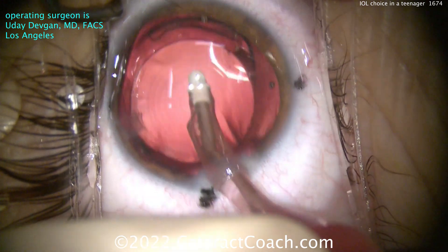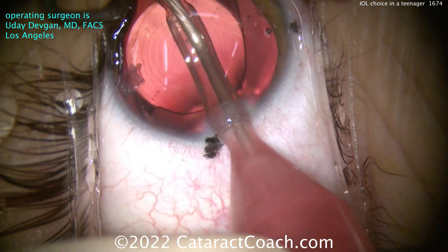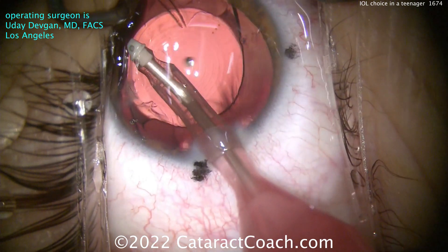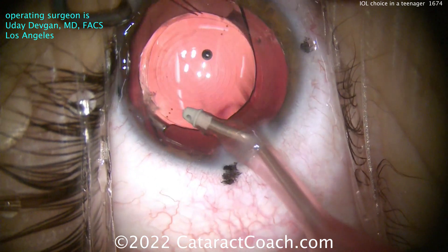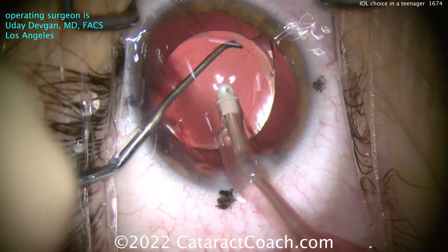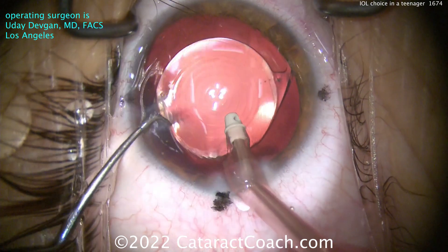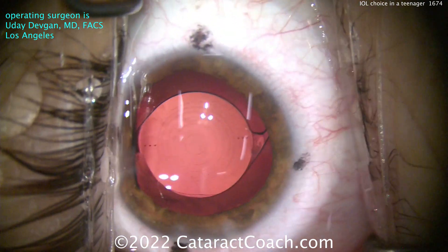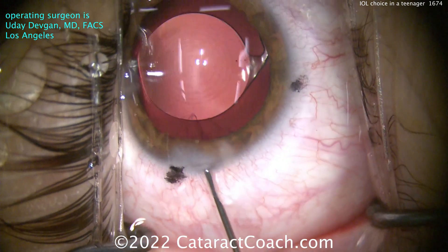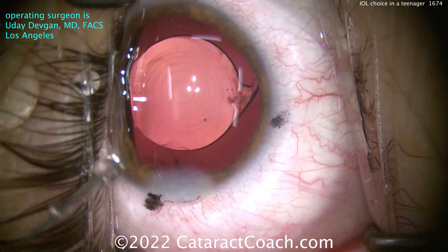So even though we're splitting the light in this patient, the patient has fantastic visual function. On post-op day one, this patient had 20/20 distance, 20/20 intermediate, and 20/20 near vision. Plus, because the patient is young, they will neuroadapt to this lens much better than an adult would. Even the nighttime glare and halos — it's much easier for the brain to adapt when you're a teenager rather than 75 years old. The patient is trying their best to hold still and look at the light, and I want to thank my anesthesiologist for a great IV sedation.